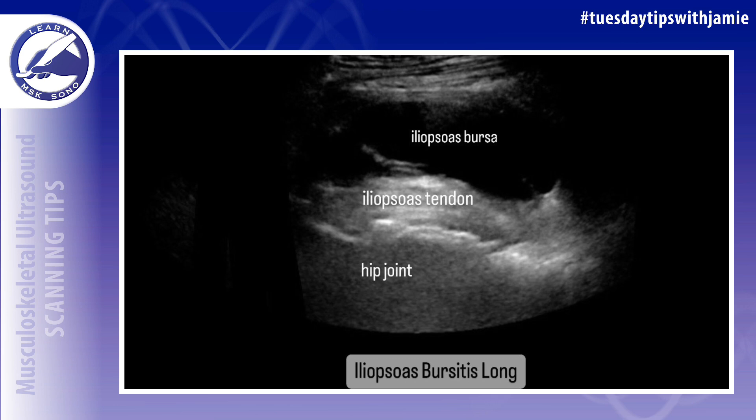The iliopsoas bursa should be evaluated for the presence of any simple or complex fluid. When fluid is present, it is important to assess the bursa for any hyperemia using power Doppler. It's also important to note whether the fluid is collapsible with transducer compression.